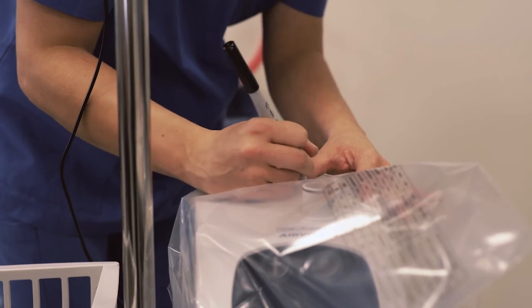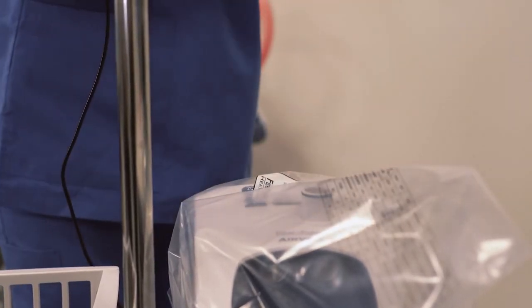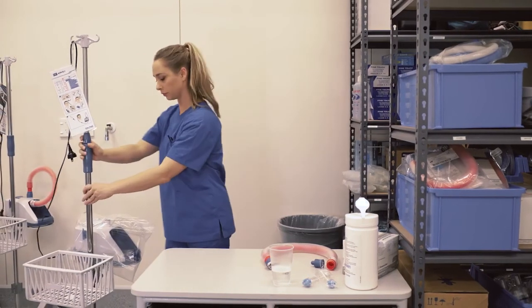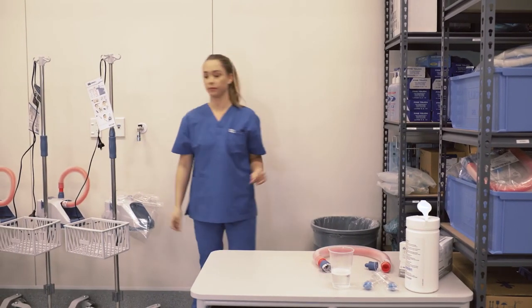Write your name, the disinfection date, and the disinfection number in the space provided on the clean storage cover. Store the unit and disinfection kit in an area suitable for medical devices, which is clean, dry, and dust free. Never store the unit until it has been cleaned and disinfected. The Evo2 is now ready for the next patient.